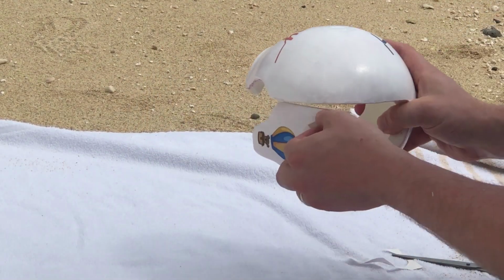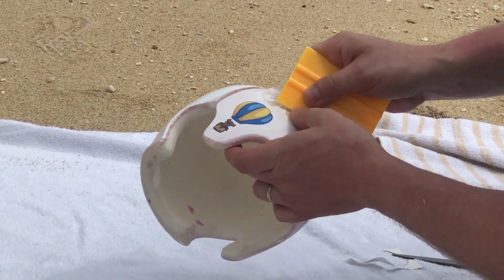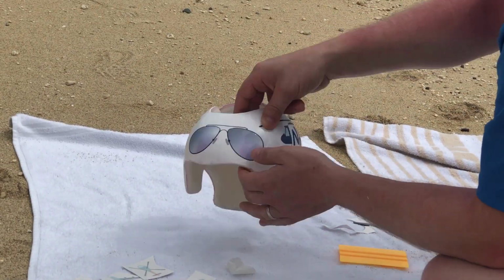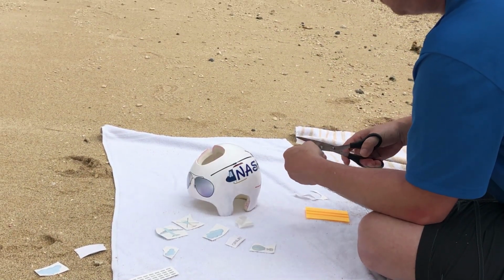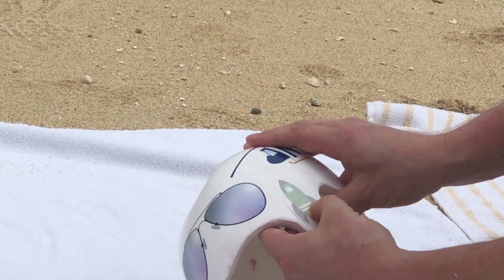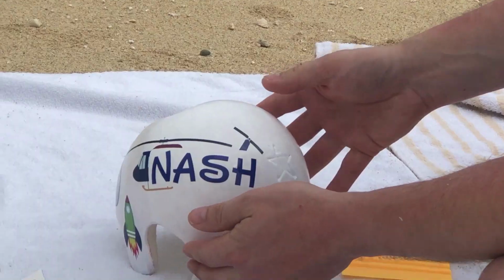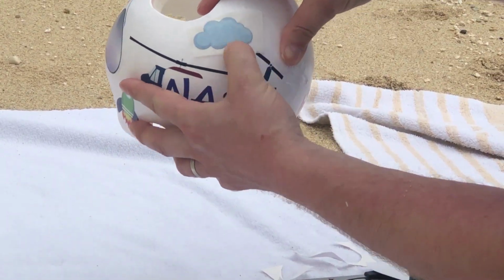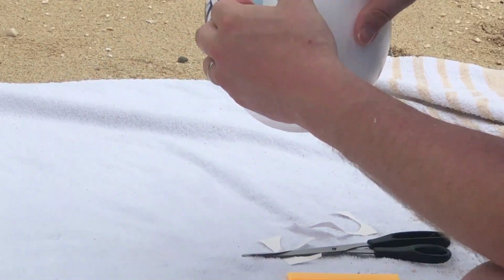Speaking of damage, we highly recommend you protect the decals with a protective hard shell like Mod Podge. The decals must be soft so they can mold to the curvature of the band, and we have printed on them. If your child can move his or her head, bedding and upholstery act as a sandpaper on the decals. It can sand the thin layer of ink, giving the appearance that the decals have faded. And it can break thin parts of the design off or lift the edges. A sealer like Mod Podge prevents all this damage by acting as a hard shell.